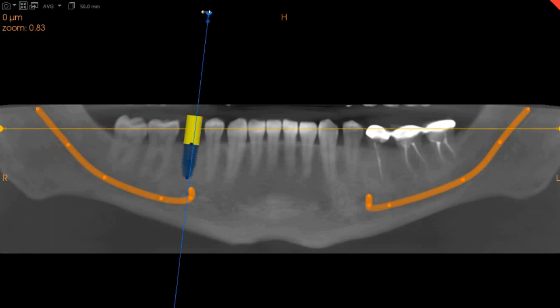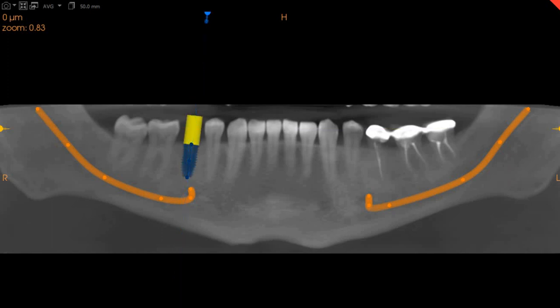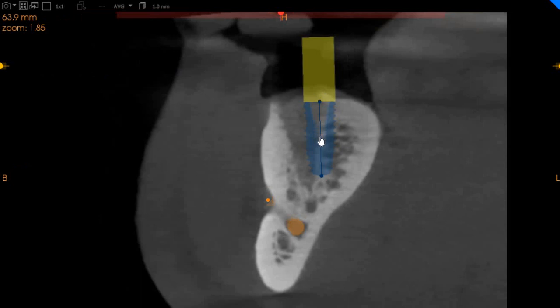But overall, a 5 millimeter implant can easily be placed here with good bone support overall. Thank you very much.